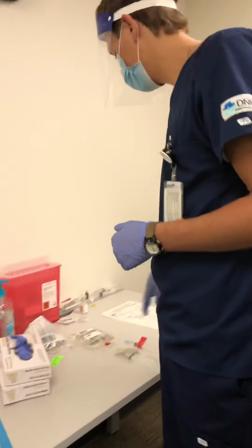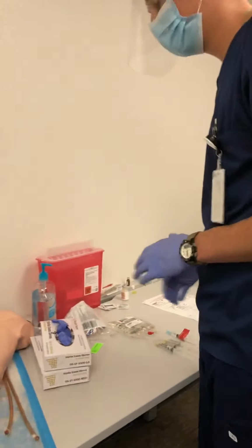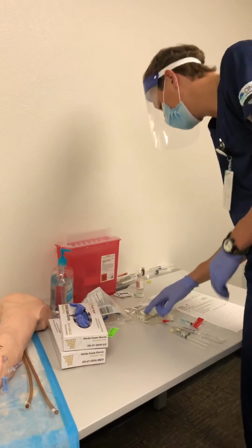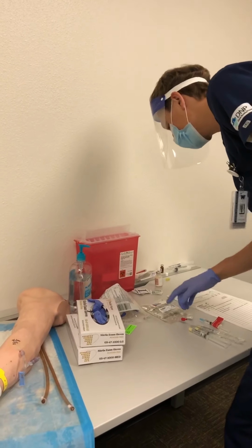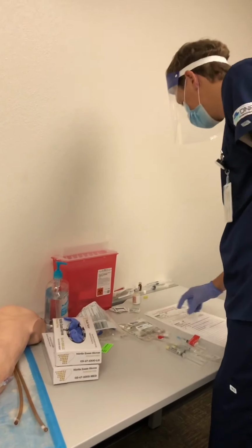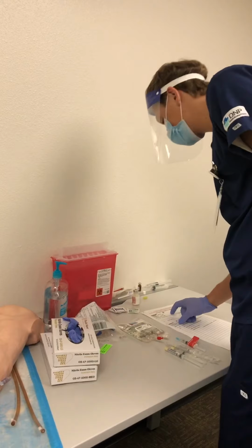Okay, so now that I am ready, I'll do my last medication check before instilling medication. So again, I have the same patient here, and then my medication here is potassium chloride at 20 mil equivalents in 0.9% saline. That matches my MAR here.